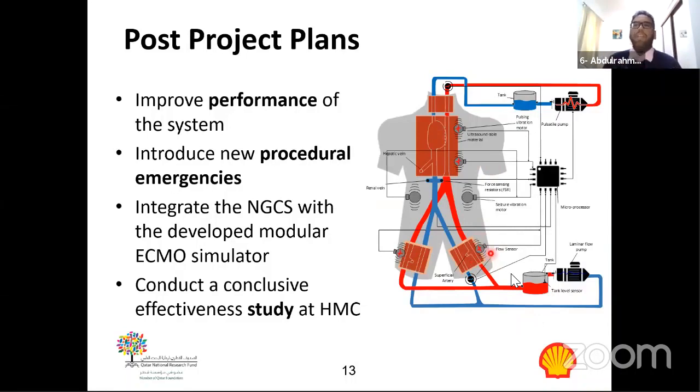When the cannulation is done, this is how the trainees or healthcare professionals can identify the arteries from the veins. This is a very genuine and interesting way to teach the trainees how to find the arteries, which can be very difficult sometimes. Thanks a lot for your comment and your insight.